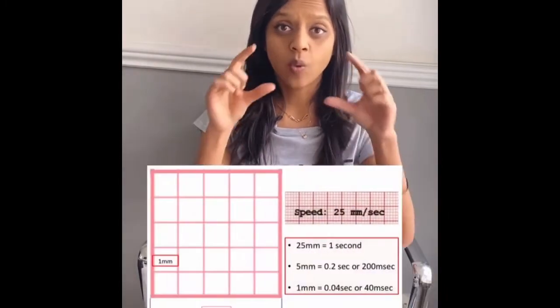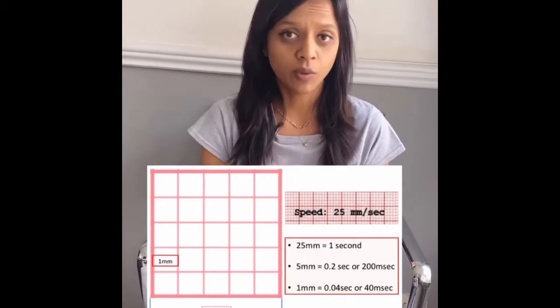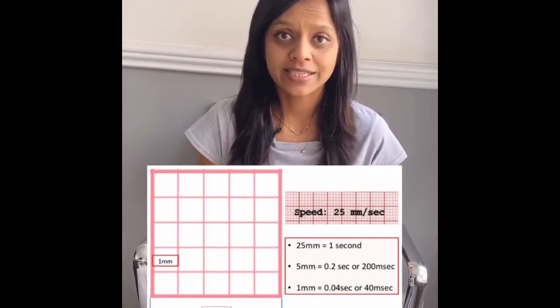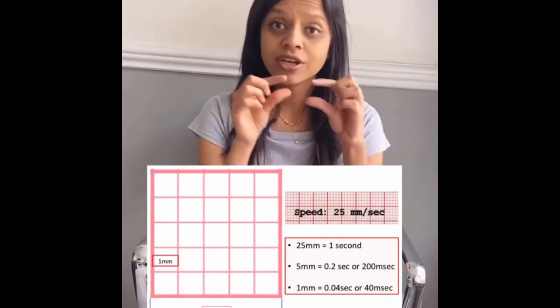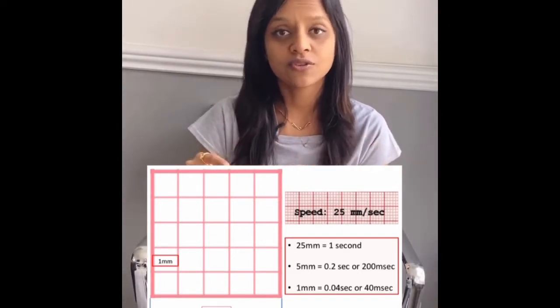So what is an ECG? An ECG is an electrocardiogram which traces the electrical activity of the heart. When we look at an ECG, we look at its rate and rhythm. An ECG has one big box, and in one big box it has five small boxes. One big box equals 0.2 seconds, and each small box is 0.2 divided by 5, which is 0.04 seconds.